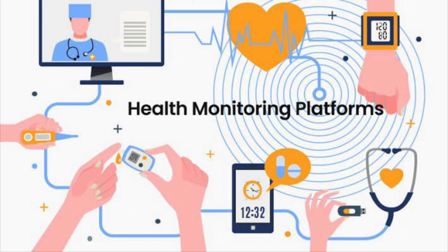And the clinicians also should be trained to how to monitor this. Here comes the problem. When you generate data from a patient for whom this is not indicated, a lot of unnecessary data is being generated. Second, any fault of the device can produce false alarms. So this is what is called false alarm fatigue or false alarm overload. So it becomes mandatory that somebody has to address these false alarms and take action based on that. So when you generate data for a subset of patients where it is not indicated, then it becomes a problem.